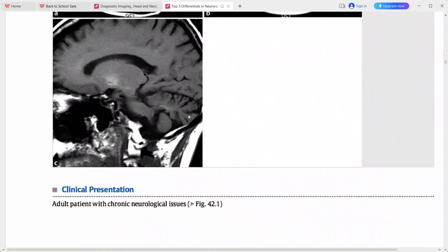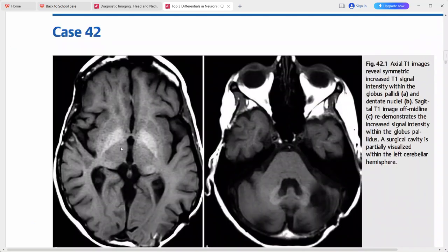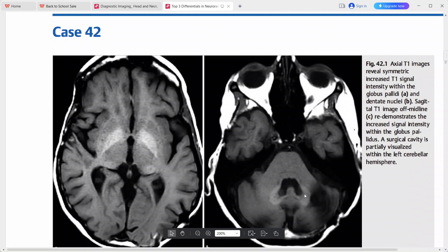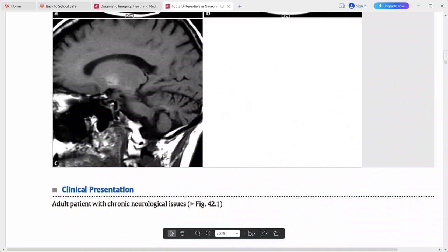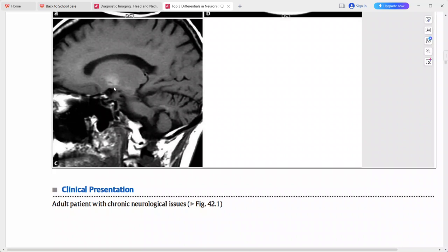This is an adult patient with chronic neurological issues. Axial T1-weighted MRI shows symmetric increased T1 signal intensity within the bilateral globus pallidus and within the dentate nuclei. On sagittal T1 there is increased signal intensity in the globus pallidus, and a surgical cavity is partially visualized in the left cerebellar hemisphere.